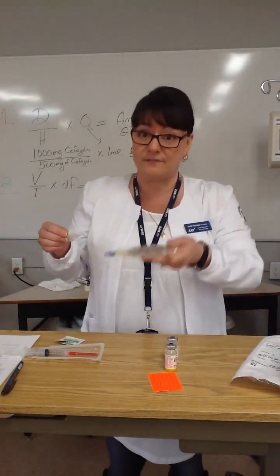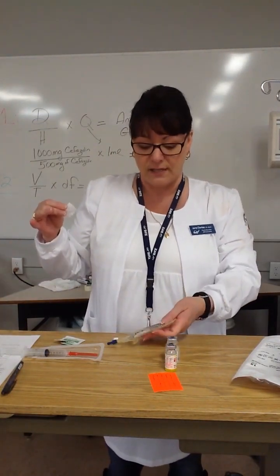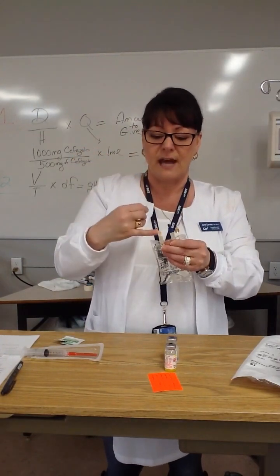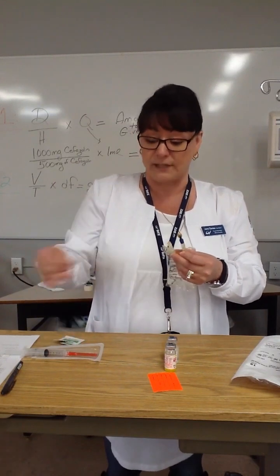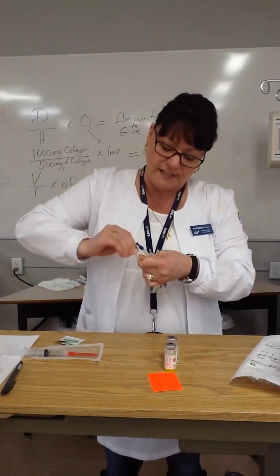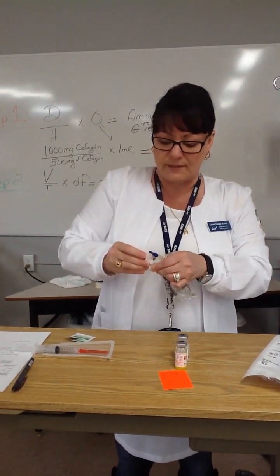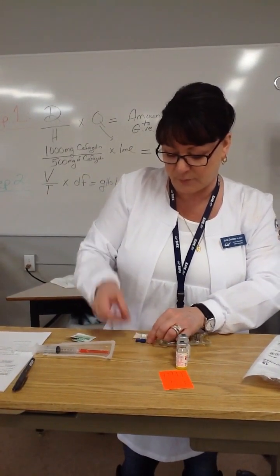I'm going to grab my 50 ml bag of normal saline that I'm going to further dilute according to my manufacturer's instructions. And I'm going to move that in front of me with the ports. You can see these little ports. One is the one I'm going to pull off and spike the tubing with. It's sterile under there. And this other little port is the one that I'm going to actually inject that needle into and inject my medication when I'm ready. So I'm going to swab that really well. So that gets a good 15-second scrubbing as well. Very important to always do your best to remove microbes. So when I'm done scrubbing that, I'm just going to leave the alcohol swab right there on it, under the table. You can see the camera's picking up what I'm doing, I think.